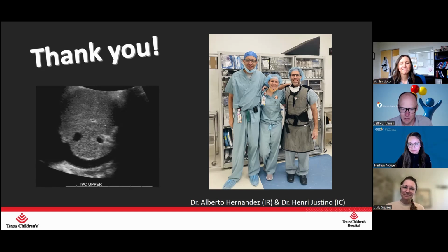And then a question from the chat was, how many samples do you get from the spleen for spleen elastography? I believe it's supposed to be 5 as well, if I recall correctly from what I've read. We're still trying it out. So right now, I think we're just doing 2, just to make sure that it can even be done. And in little kids it's extremely hard. For some reason, it's just harder to pick up. And so getting 2 seems like a task just to try to get those 2 samples. Getting 5 would be extremely difficult in some of our patients. But I think that is 5. I think when we start billing for it, we'll have to do 5 samples.